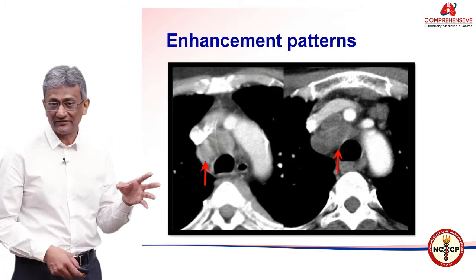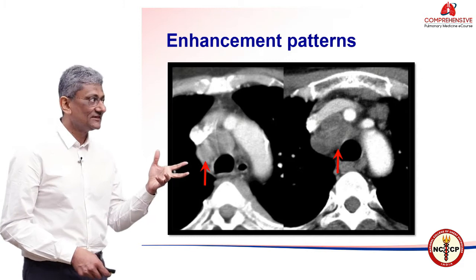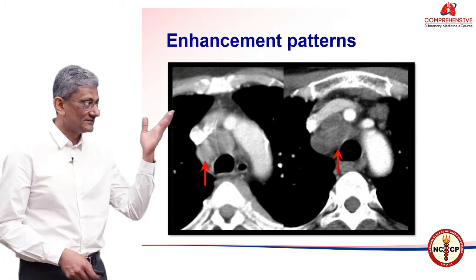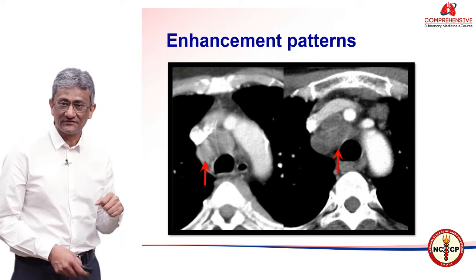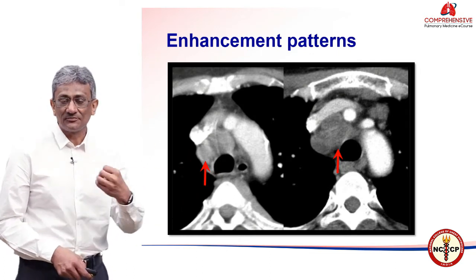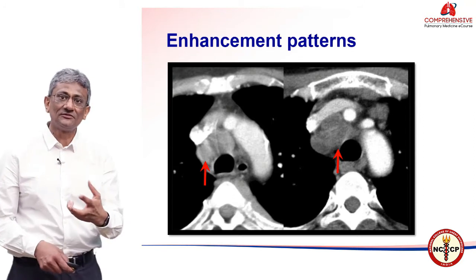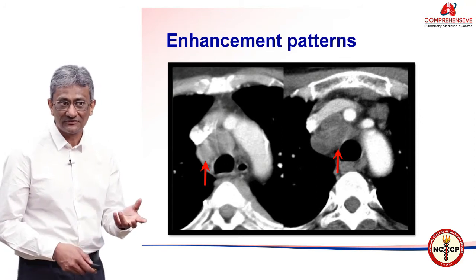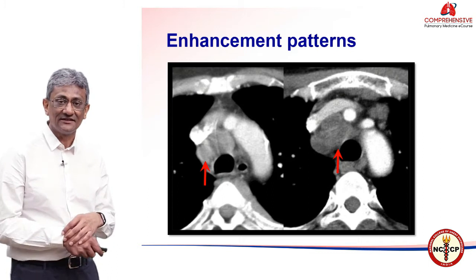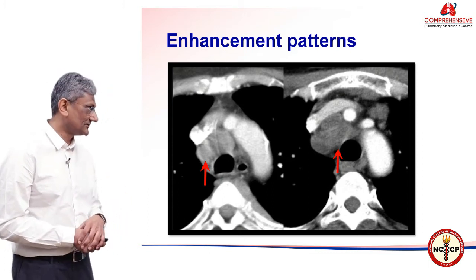Whereas the lymph node on the right shows necrosis — only the periphery is enhancing, the rest of the node is not picking up the dye. The presence of necrosis in the appropriate setting in our country often allows us to make a diagnosis of tuberculosis in the young patient, or perhaps metastatic disease in the elderly if the patient has a known primary.